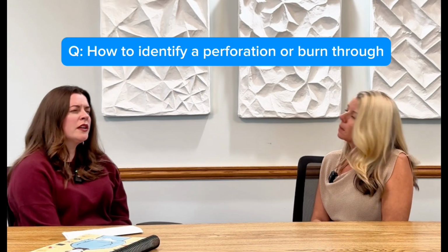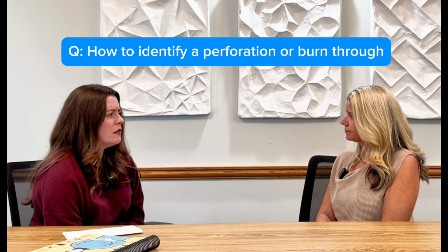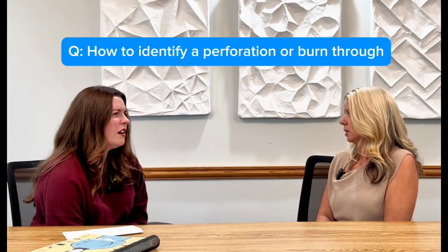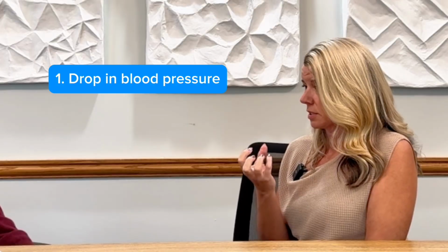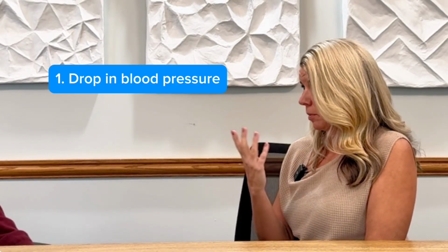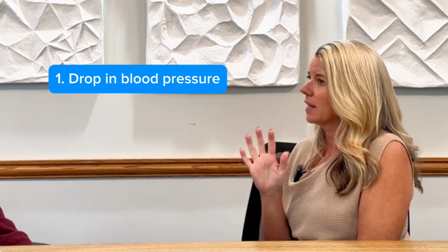Yeah. Can you pick up a perf, besides just going based off impedance, on mapping, or not really? On mapping, no. And not on the intracardiacs, because it's just not on intracardiacs. Electrical conduction. So the first thing, hemodynamics, all you have is a non-invasive cuff. So if you have a perf, the first thing that you will start to see is blood pressure. You'll have a dramatic drop in blood pressure. They'll say, recycle the BP. You'll recycle, but then they can step on fluoro.